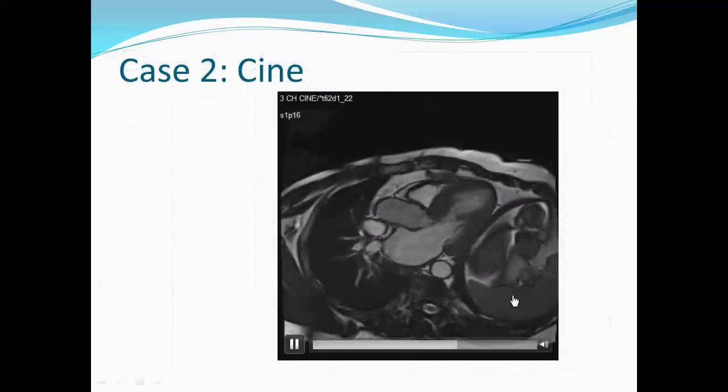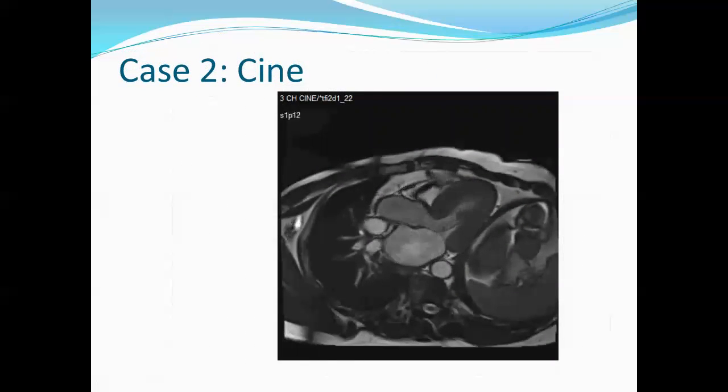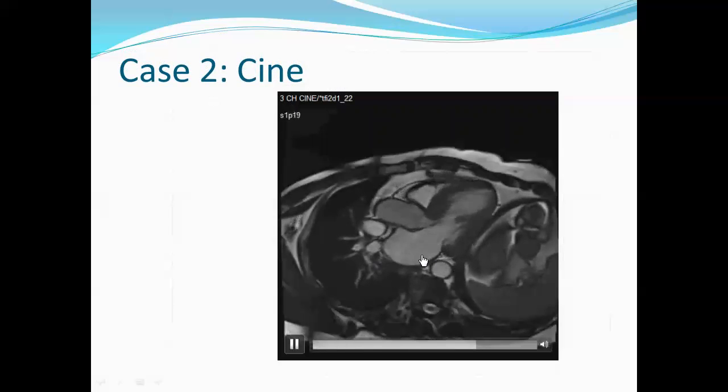This is your equivalent to your parasternal long axis. And those of you who came to imaging conference, I think the first conference in September, have probably seen some of these images because they talked about HCM at that time. So again, this posterior directed jet of mitral regurgitation, and you can see just the tips start to lean in towards the interventricular septum, and then you can appreciate the flow acceleration, which is that bright coming across the LVOT and going into the aorta, but yet the leaflets are opening, so you know it's not aortic stenosis.